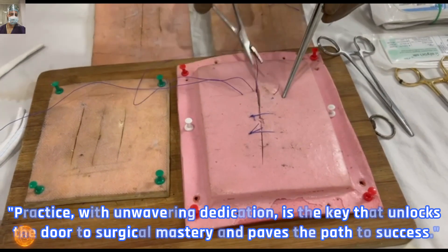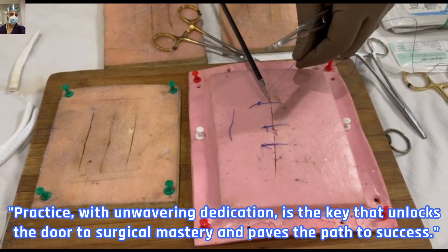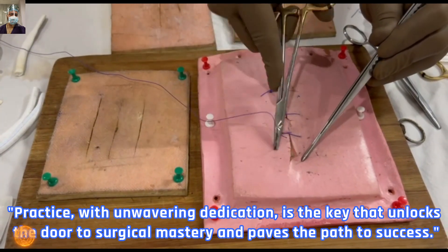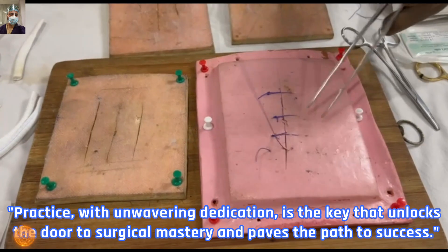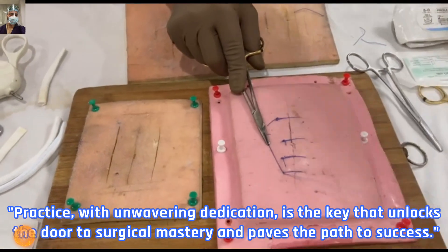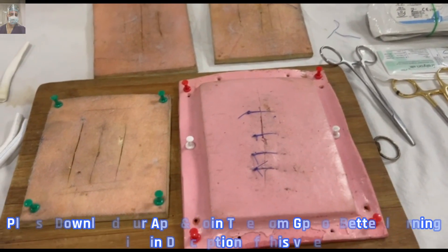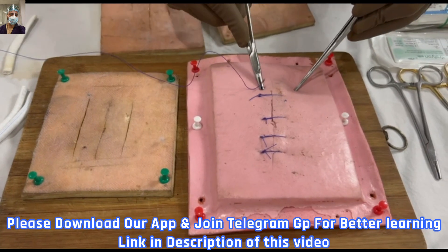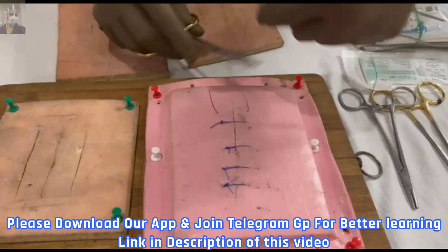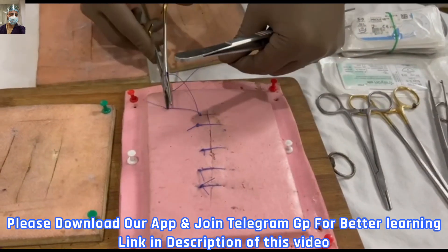This rule of halves can be applied with interrupted or vertical mattress sutures, which we have already discussed. This channel and most of our videos are for someone venturing into the field of surgery — if you are already a seasoned surgeon, these videos may not be as relevant to you. We keep advancing sutures this way. How to tie the knot with the help of an instrument, how to apply the surgical knot, how to lock the suture, two throws, three throws — we have already covered that in parts one and two, so do check them out.